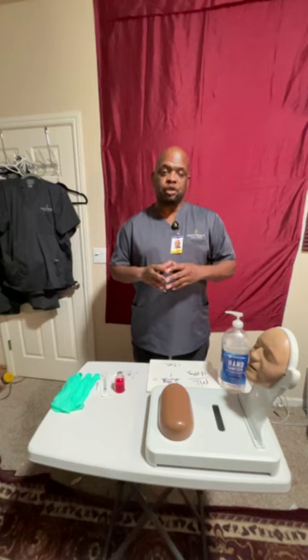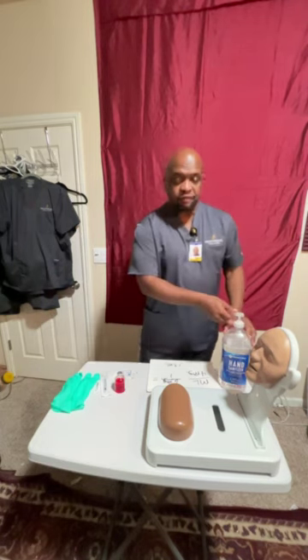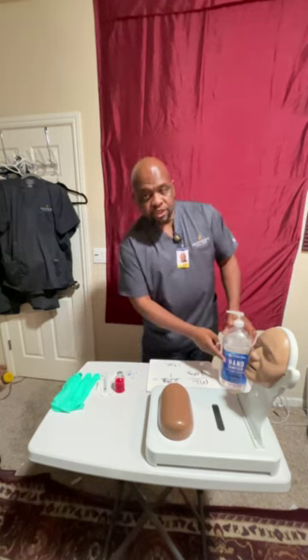Today, I will be performing a video skill for you. It will be the video of intramuscular injection. So first things first, I just get to the facility, and before you touch any medication or do any type of patient care, you always need to do hand hygiene. I'm using the alcohol gel hand sanitizer.